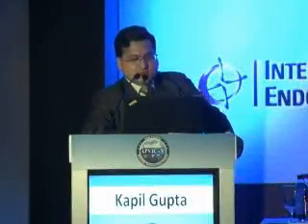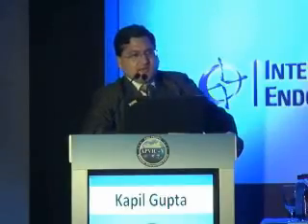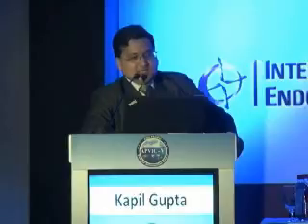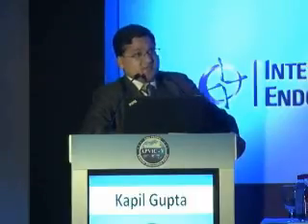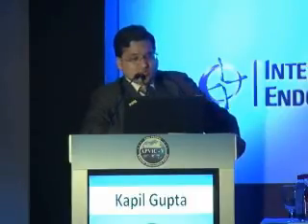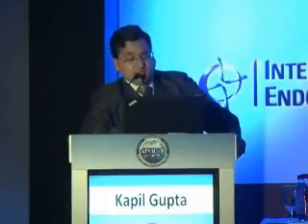So I just wanted to conclude by saying that the retrograde approach for tibial occlusions is a valuable technique if an antegrade recanalization attempt fails. The technique is safe regarding the puncture site of the distal artery. Of course, we have to provide compression for almost 20-30 minutes at the distal artery puncture site and make sure that there is no leak before we come out of the cath lab. The clinical success is very acceptable and supports the use of this technique.